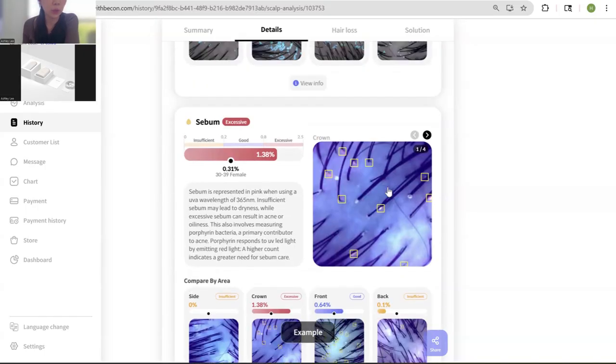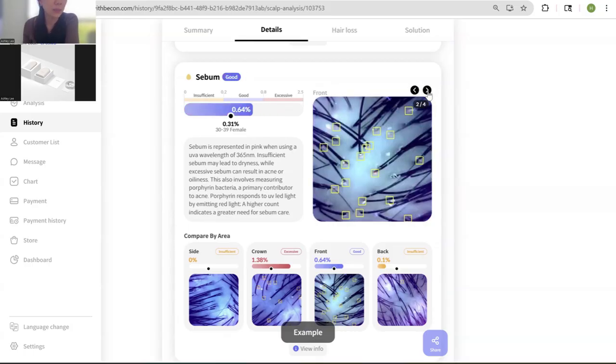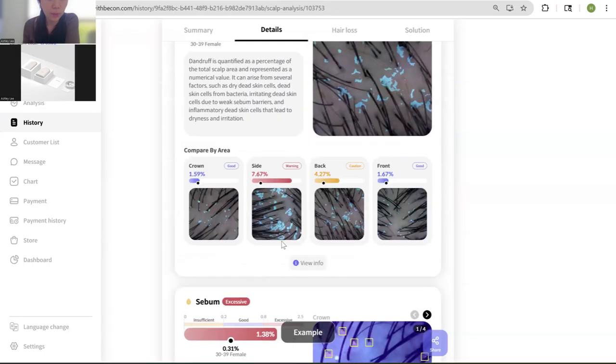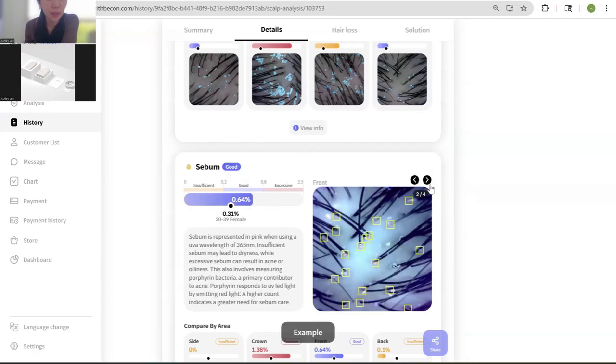When you capture the image, we ask you to hold the camera for 4 seconds on the certain area. The reason is that through the UV lights, we are able to detect the sebum. Whenever we detect excessive sebum, we highlight it with pink and a yellow box. We show the sections from the worst. It's not the number of sebum but the size of the sebum. If we see a bigger sebum, we highlight that section first as well.